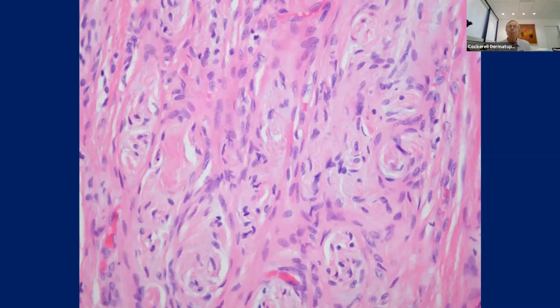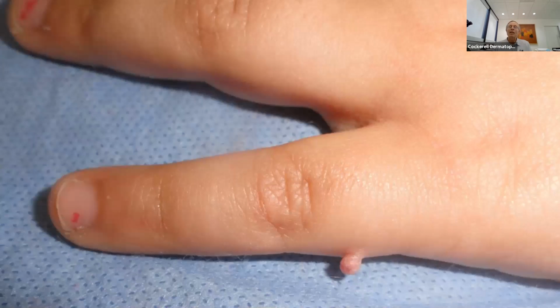So that's really what we're looking at: a traumatic neuroma, but that's kind of what's left over from the accessory digit that was present here. And sometimes you'll see an accessory digit that really looks like a little teensy tiny finger. It's got a small focus of bone, it's got a little focus of cartilage. So if you get one that hasn't ever been damaged, and it's really and truly one of those, you'll see that component of it.